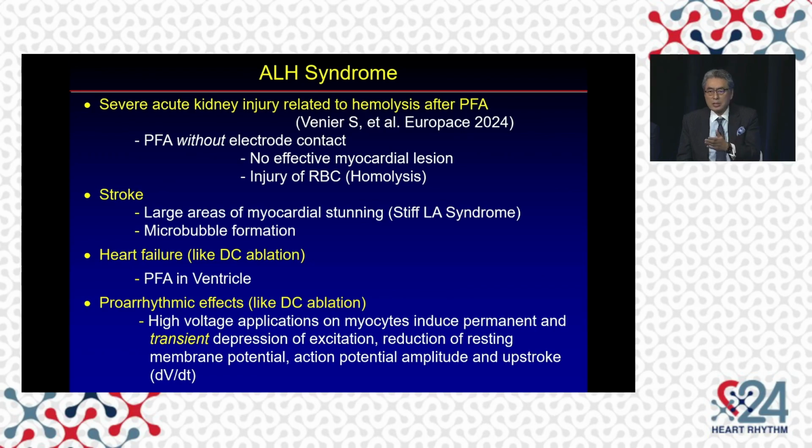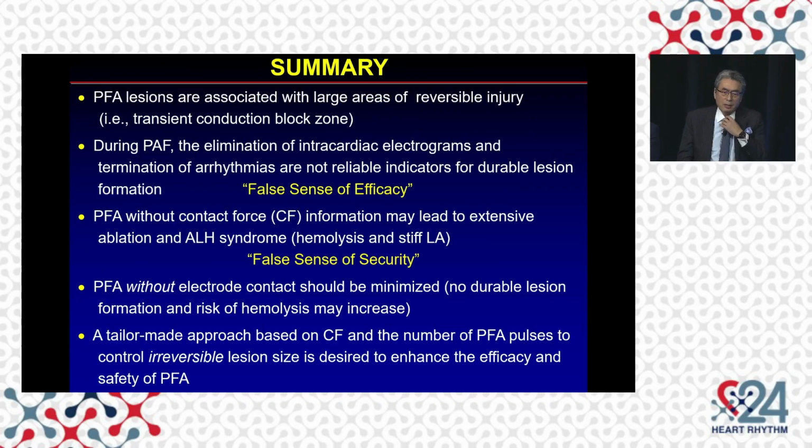Also like DC ablation, the physics is not much different for PFA versus DC, the pulsed field ablation. We know there was some adverse effect, which is the pro-arrhythmia effect in DC ablation. We don't know about PFA yet. In summary, PFA lesion is associated with a large area of reversible injury, i.e.